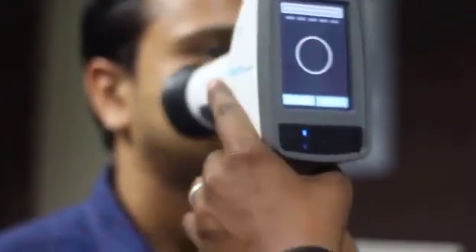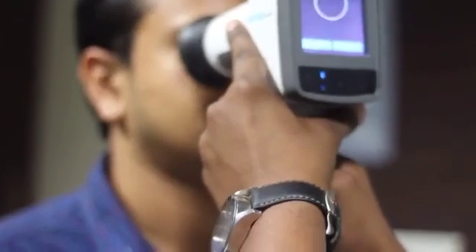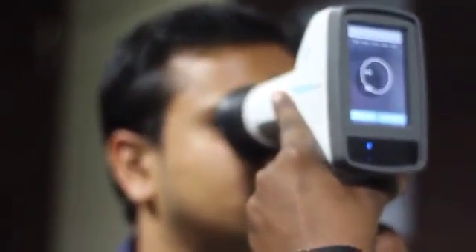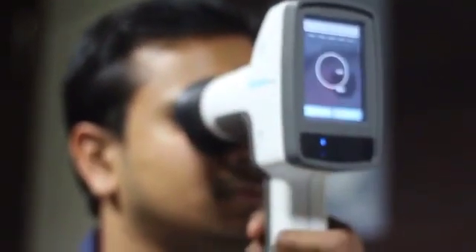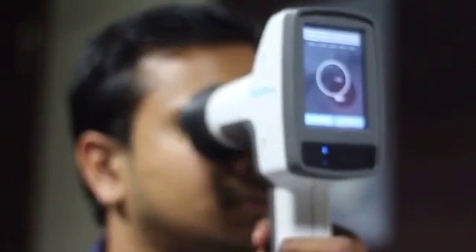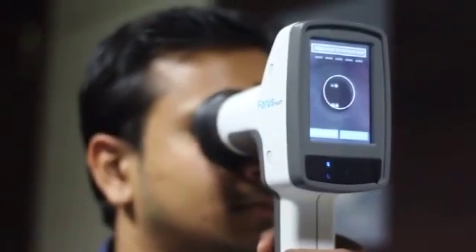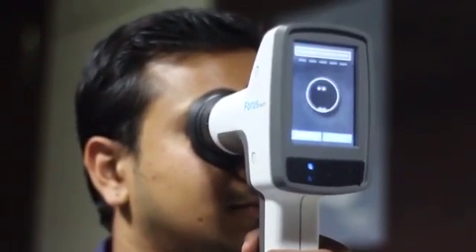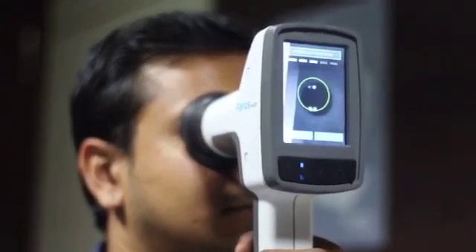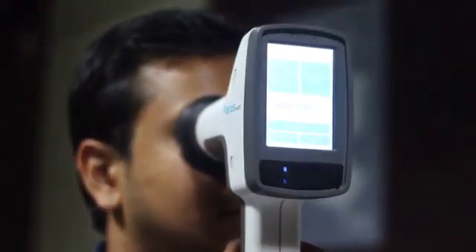Once we approach towards the patient's eye, we could see four dots - top two dots and bottom two dots. By aligning with that, we can capture the image. Once we have aligned, we could see the readings.